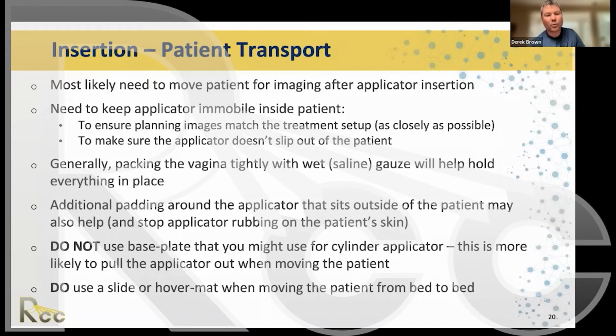If you have a patient where you're having a very difficult time meeting the small bowel or sigmoid dose constraints, and you can see that if you filled up the bladder a little bit it would push that away, then maybe for the next fraction, let's fill the bladder and see if it pushes the sigmoid out of the way. But for some patients, anatomically, that's just not going to make a difference at all. Some patients have really large bladders to start with, some have really small bladders. So bladder filling is a more difficult question, and it's probably patient specific. Rectal filling is more definitive and should be avoided.